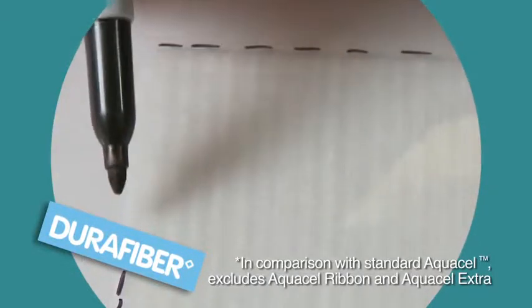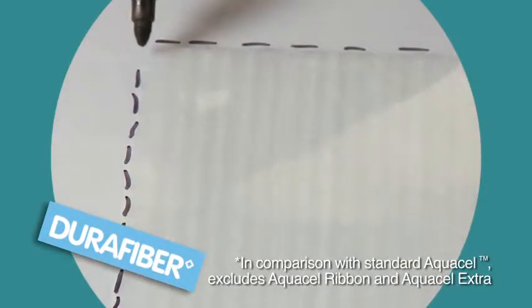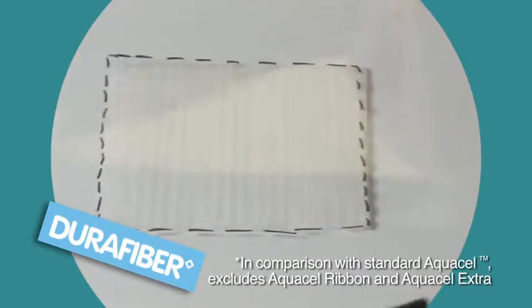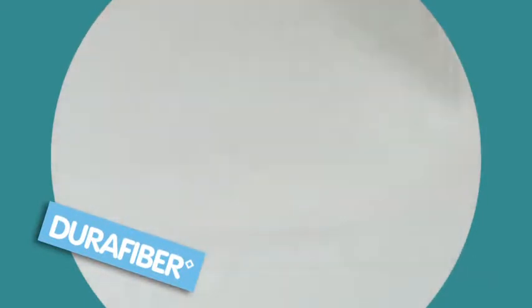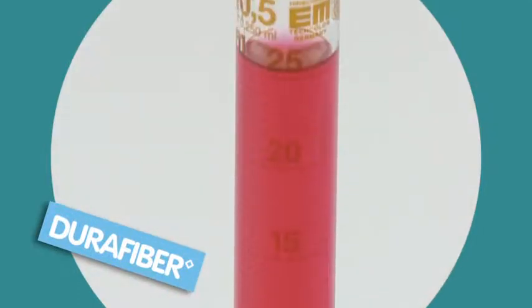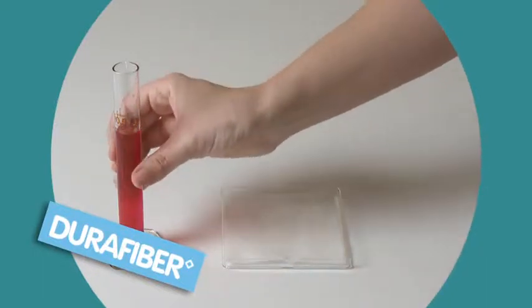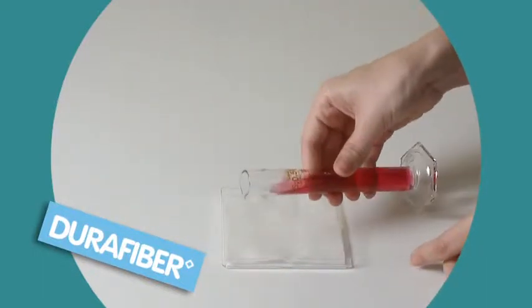We've devised this test so you can see for yourself. First we mark round the dry dressing so we can see how little it shrinks when wet. Here we've measured out 25 millilitres of coloured saline fluid. DuraFibre is placed in a petri dish and the fluid is added evenly across the dressing.